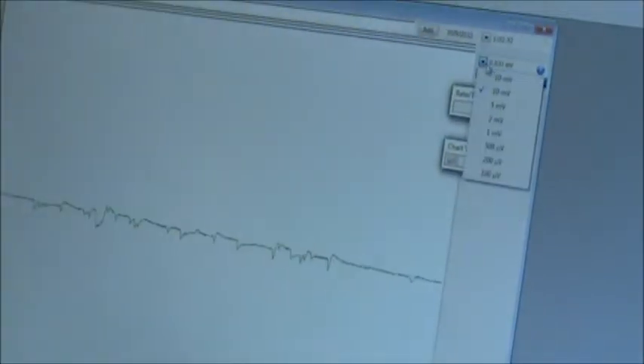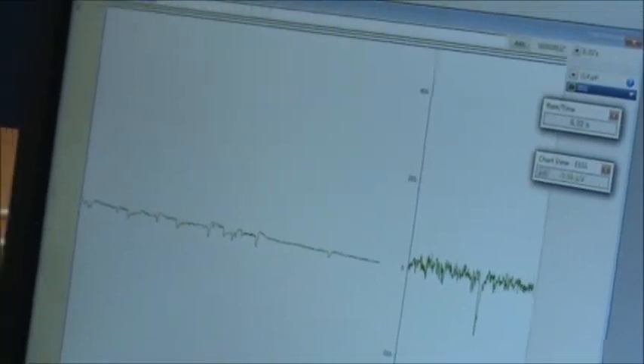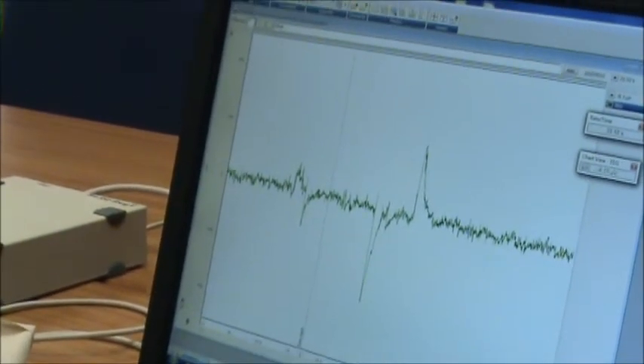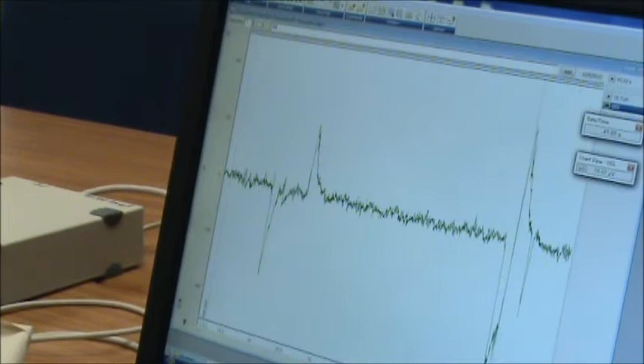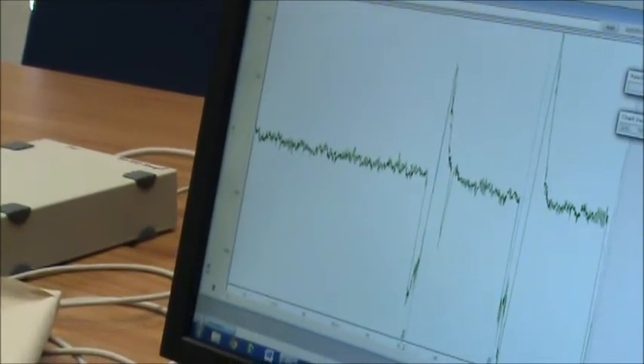Now I'm going to change the gain to 500 microvolts and ask Ellen to be really still but to keep her eyes open. I'm going to write 'eyes open' up here in the comments section and press Add or hit Return to mark it on her EEG. I'll let it sit for a minute, then type 'blink' before asking Ellen to blink so we can see the effect on the EEG. Okay Ellen, blink — and blink again.